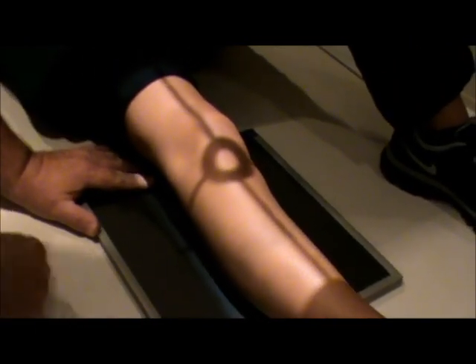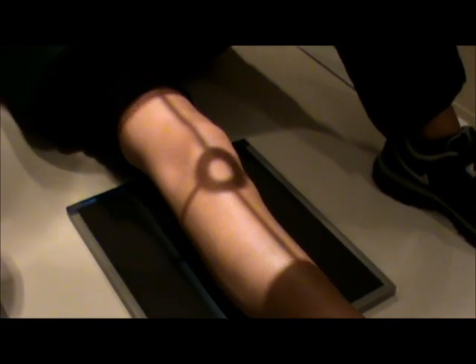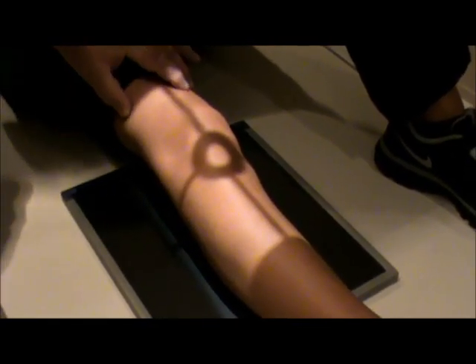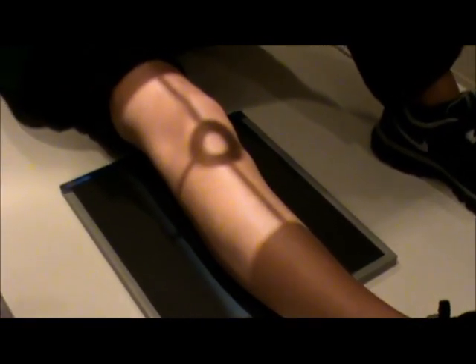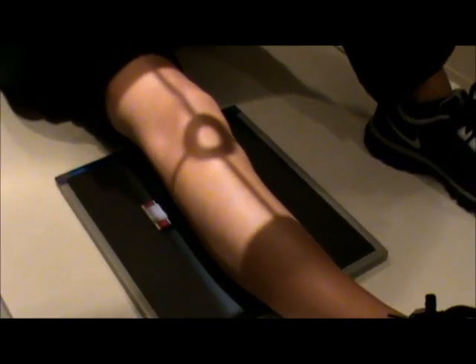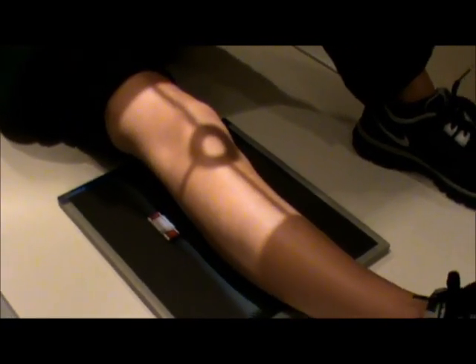I'm going to adjust my film so I am centered. We need to include the entire joint and as much of the femur and tibia-fibula that we can include on the film size. Our marker placement is going to be in the light field but not obstructing any pertinent anatomy. And again, this is our AP knee view.